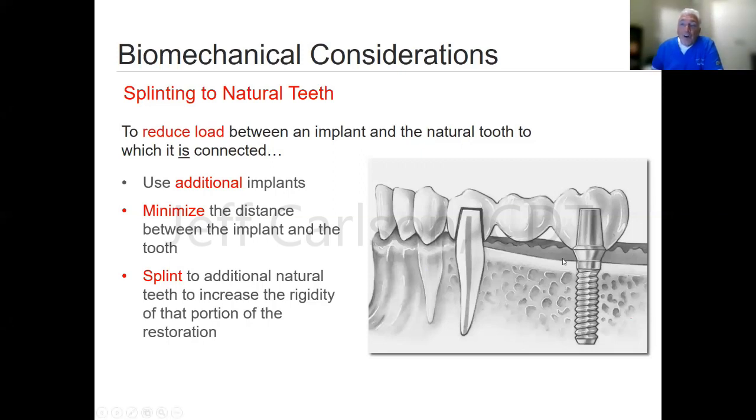for saucerization or bone loss here on the mesial, and you're going to see it probably on the mesial and maybe also on the distal, especially the distal, I apologize. Because when the load comes down here and it gets a little teetering like that, the bone right here, the bone at the implant, is under more of a compression force. And because this side is wanting to lift, because the bridge is wanting to go like that, that is under tension. And we just looked at how tensile forces are 35% more stress than compression strength when it comes to forces of occlusion.